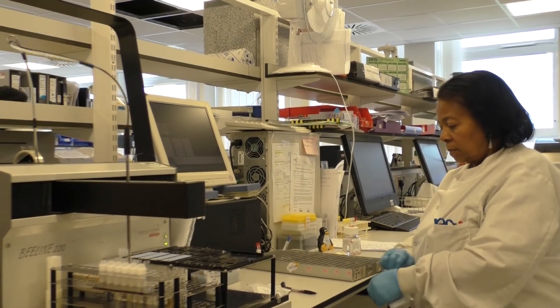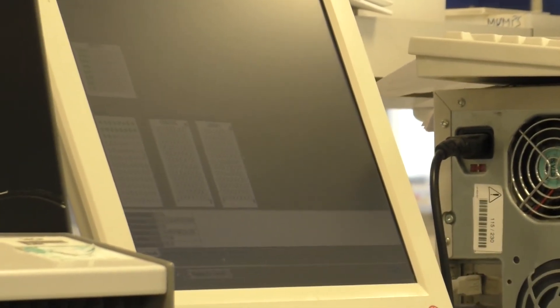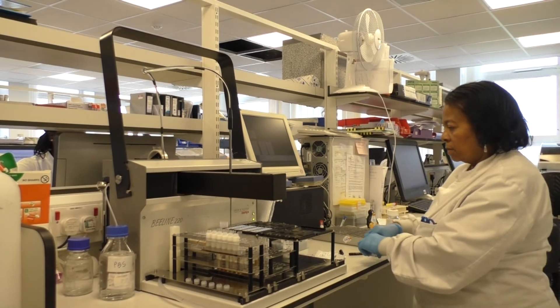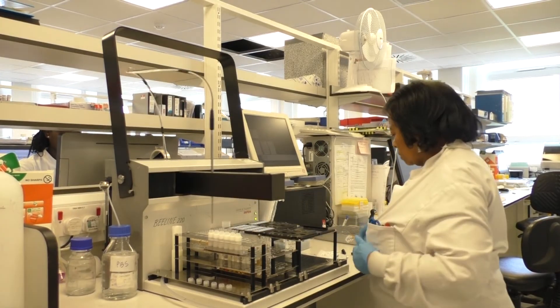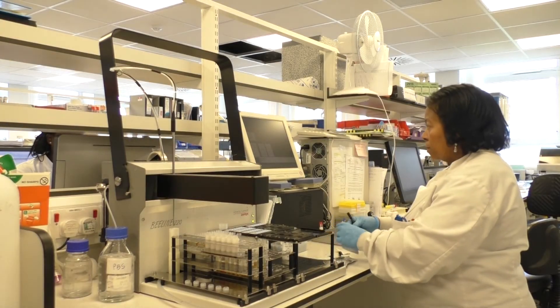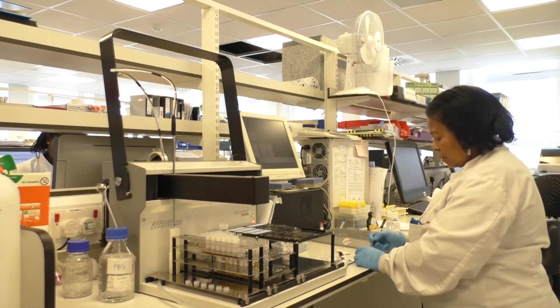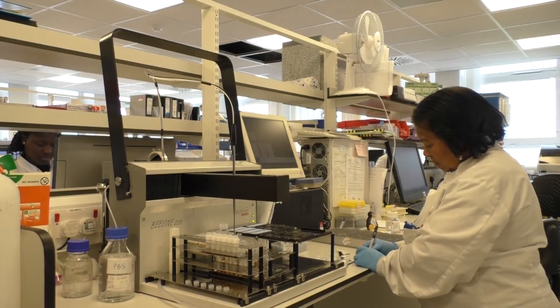The control screen for the machine indicates where the samples are being added and will flag up any pipetting errors, so that we can intervene and add samples, dilute them and add them manually if the machine hasn't pipetted them properly. It indicates where the samples have been put with a green dot, and if there are any errors it puts in a red dot — colour coded.